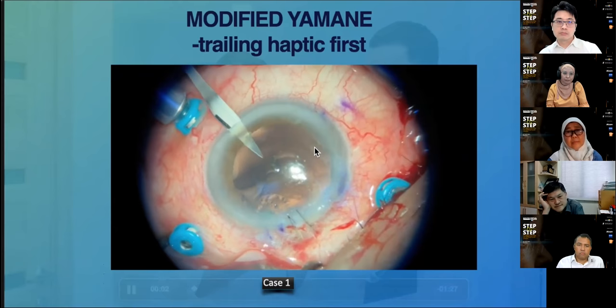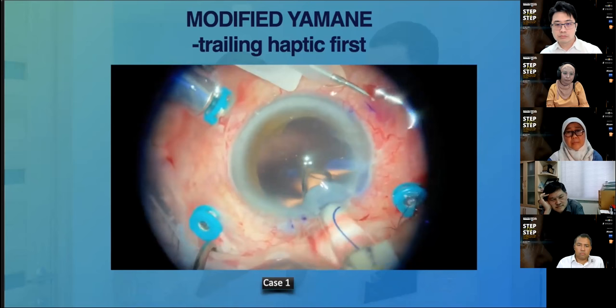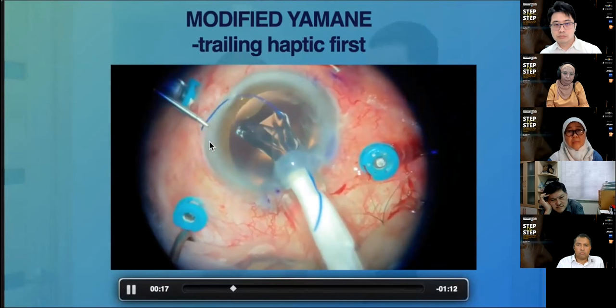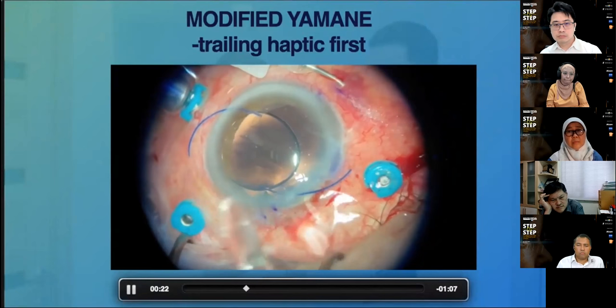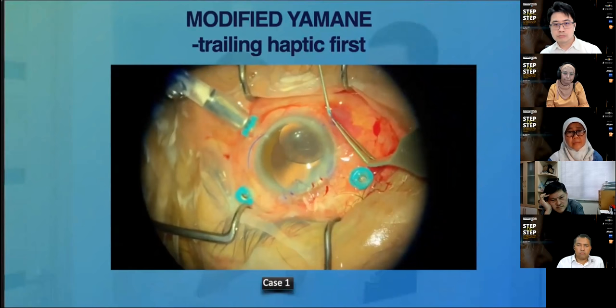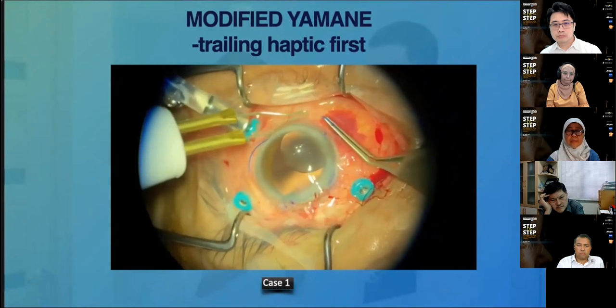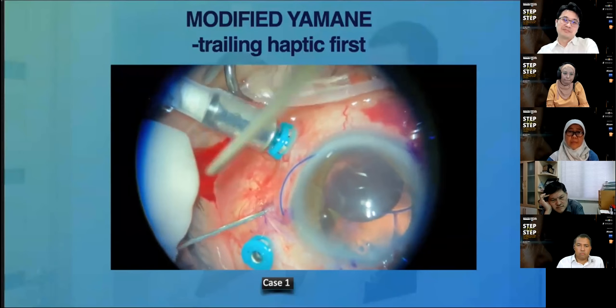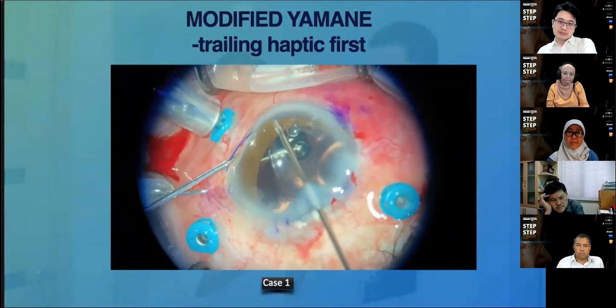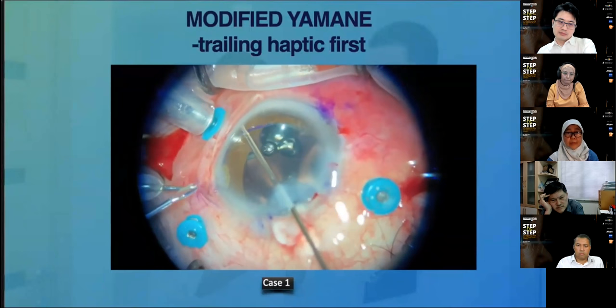This is a case of a post-vitrectomized eye. This was after removal of oil, and we decided to insert the scleral fixated lens. So we create a paracentesis 180 degrees away from the main wound and, using a forceps, pull out the haptic, park it outside, and then use the forceps to thread in the trailing haptic. And then once we have secured the trailing haptic, only then do we create the tunnel for the second haptic. Now push the leading haptic back inside and then thread it into the needle.